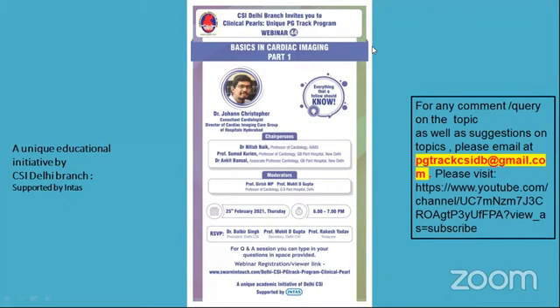It looks at the T1 before gadolinium and the T1 after the gadolinium. Since it is a kind of ratio, it is more objective and can be traded across centers in the country. So my ECV would be approximately similar to the ECV that you get, provided you've taken care in giving the right amount of contrast, waiting for that 10 minutes, and then repeating the T1.